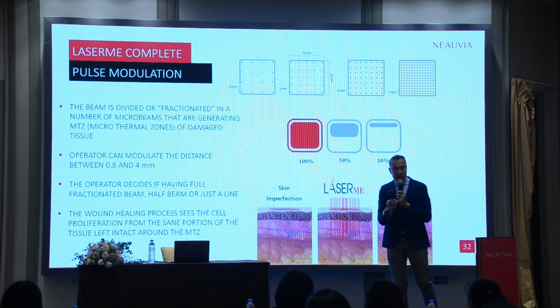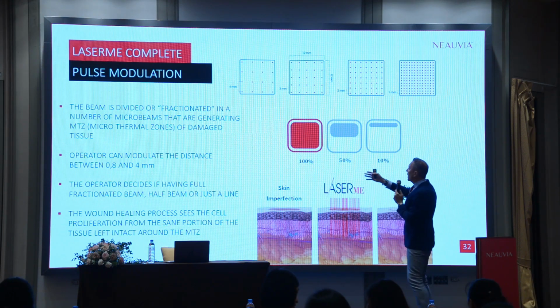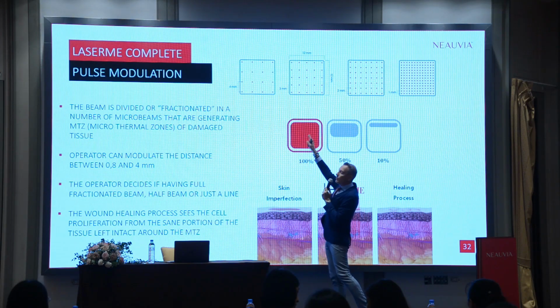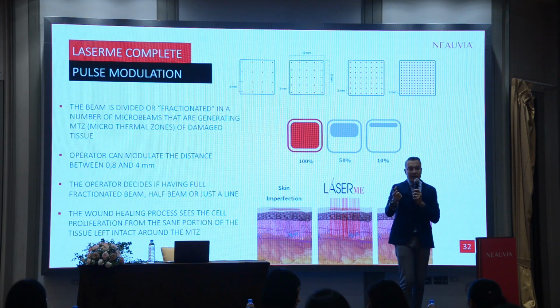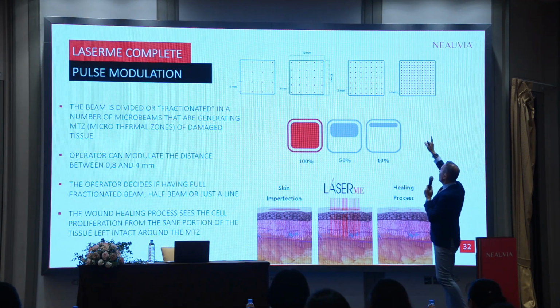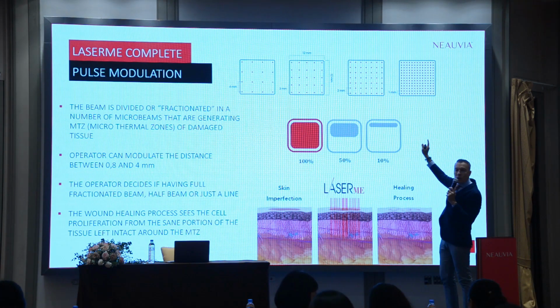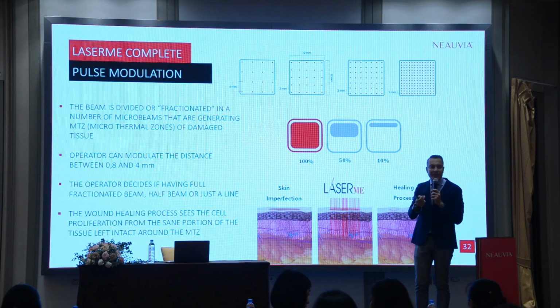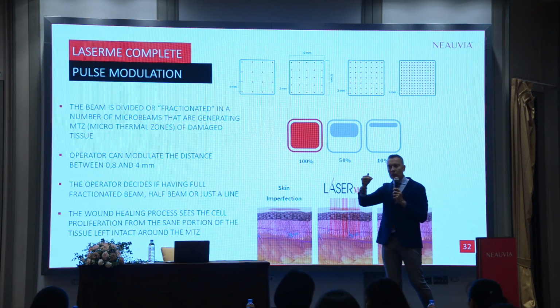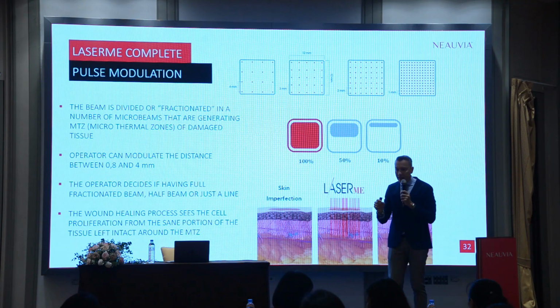Why is this important? Because if I want to treat acneic skin, I can use these parameters without any problem. But if I have to treat stretch marks, post-acne scars, I need to use a very high density, low spacing, with a pretty high fluence. Otherwise, I will never have good results. So this is the main advantage of this laser in comparison with the other existing lasers.